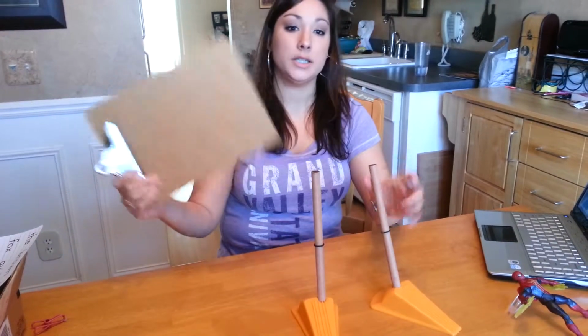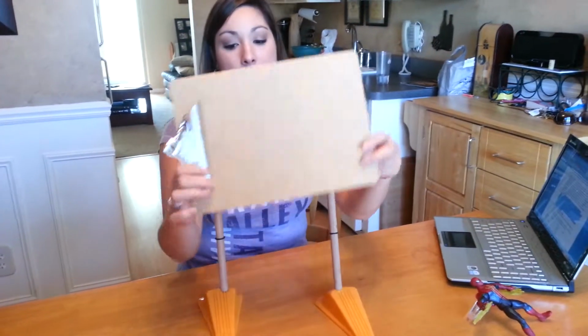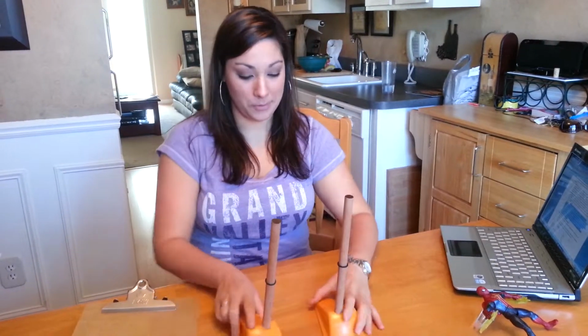And they're in the right circumference or diameter, and they just kind of slide on and off. Then I purchased a clipboard from the dollar store, so it was $1. And then I used the leftover hook and loop from the splinting activity that we had. So thank you, Grand Valley, for the hook and loop.